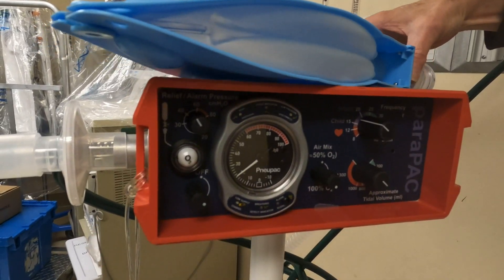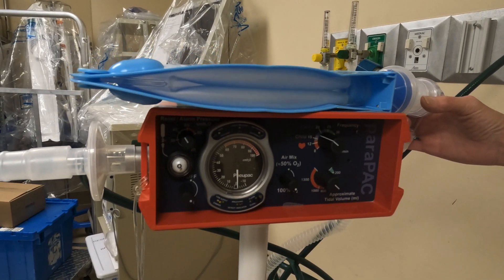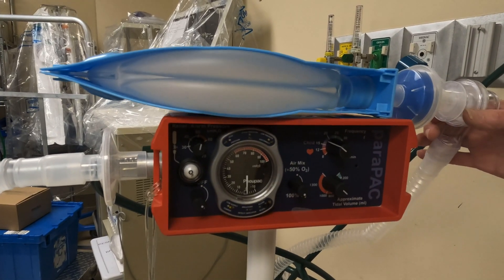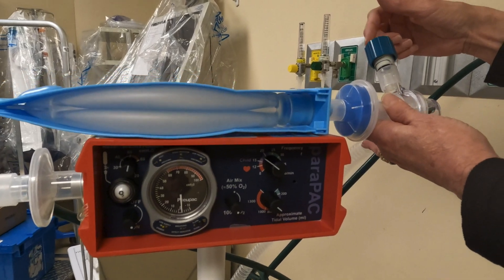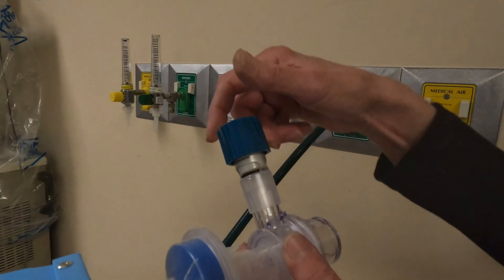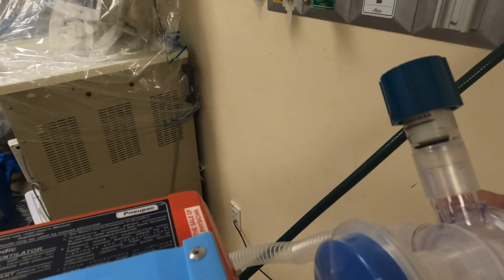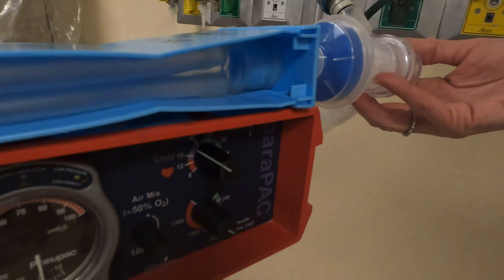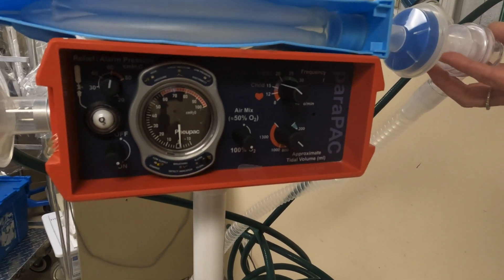We have our circuit set up, our patient is ready, and we are going to turn it on. That beep lets you know that you're getting close to your peak pressure limit. You are able to adjust PEEP here on the circuit — each one of them comes with its own PEEP valve — so we'll go for five. You are now ventilating and oxygenating your patient on the Para Pack transport ventilator.